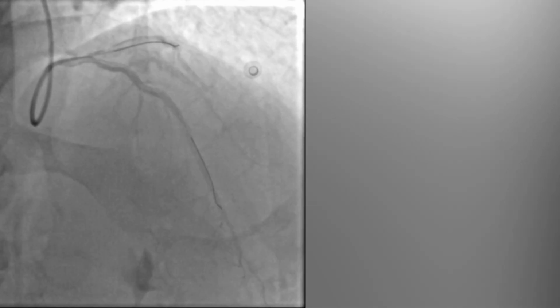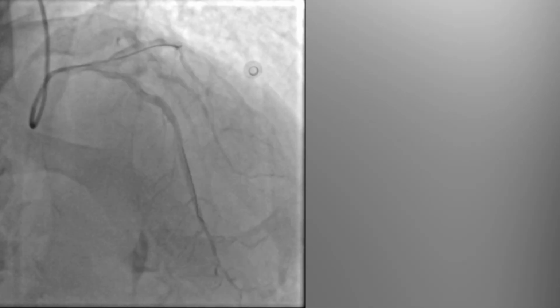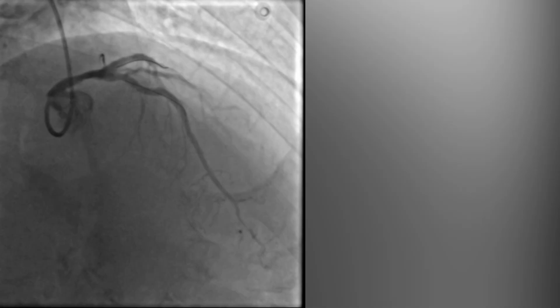In the final angiographic image, the LAD is widely patent with significantly improved coronary flow, which can be clearly compared with the pre-intervention image.